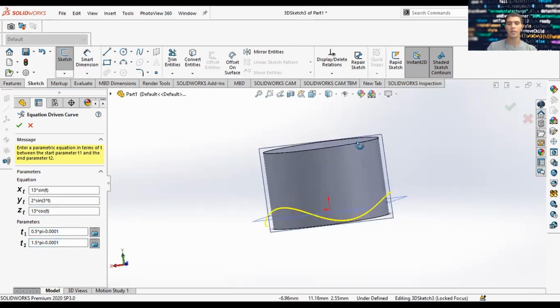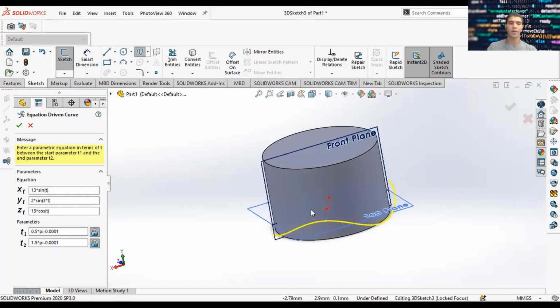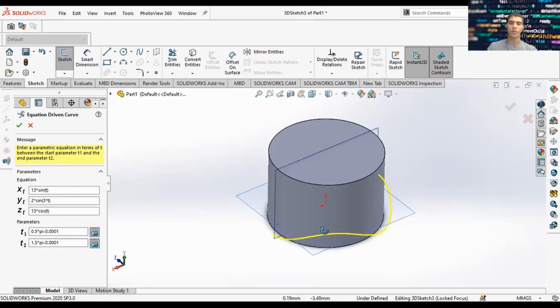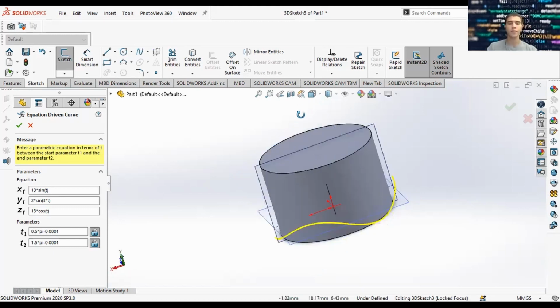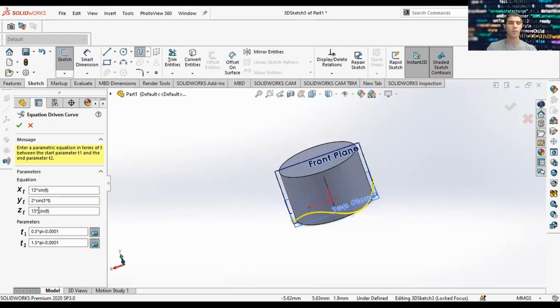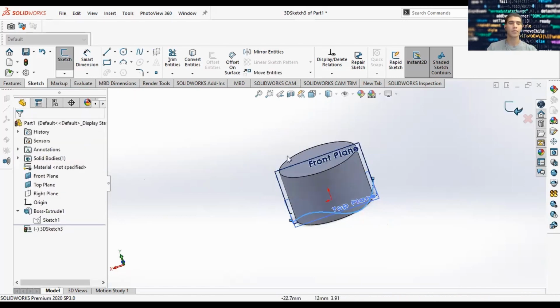So we're starting at half pi and we're ending at 1.5 pi. If we began at 0, then we would begin here where my cursor is right now, and then we would finish all around at 2 pi. You'll notice because of this y function, y(t) = 2 sine 3t, it's going to go around the entire cylinder 3 times. So it's going to have like 3 peaks, as you'll see in a minute. So we click OK, and that's good now.